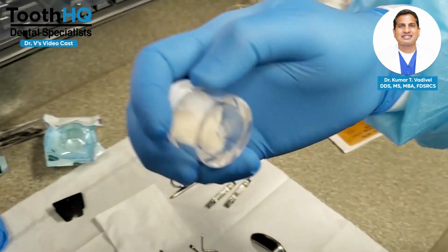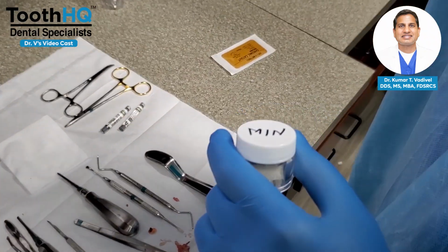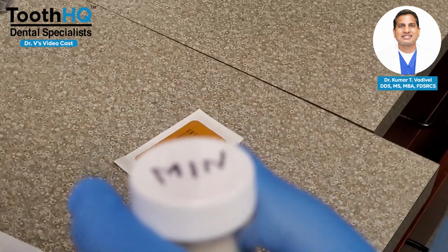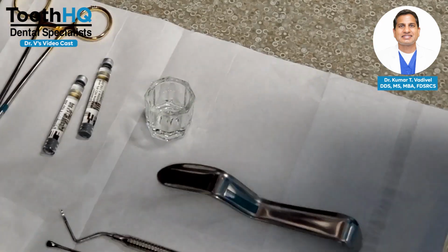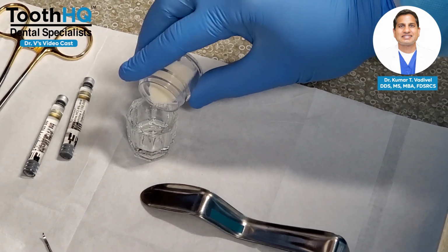Okay, so what I'm going to do is I'm going to put this in a dappen dish, and I'm going to show you how to mix it. I have the dappen dish ready, and I'm going to pour the bone here.